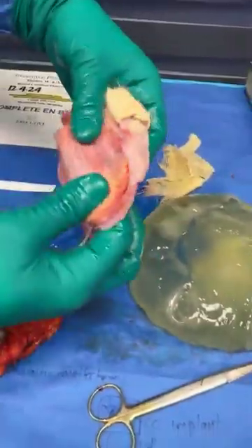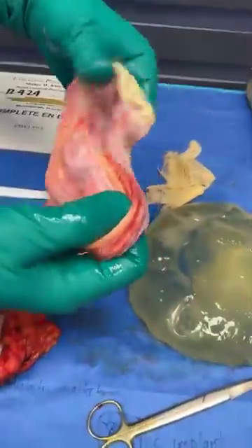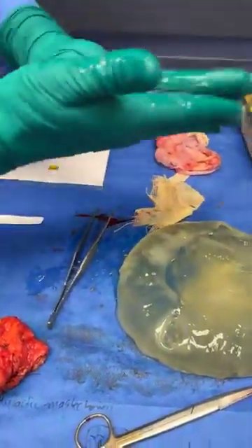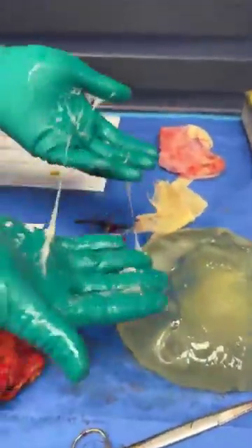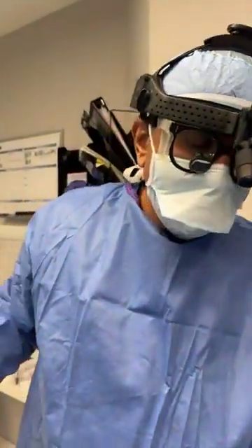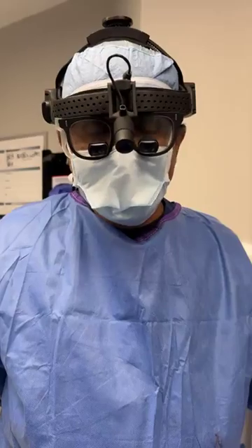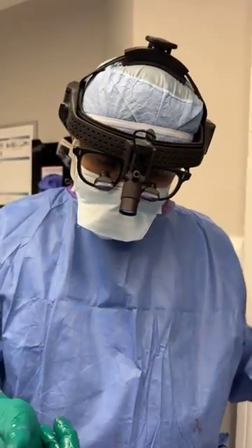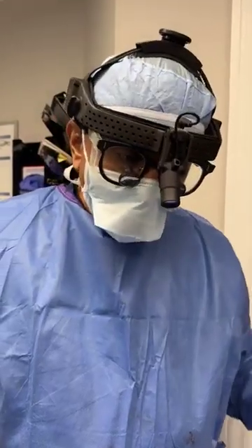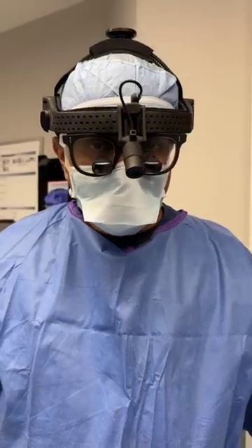The other thing I want to emphasize here is you can see some areas are so thin, as you saw earlier. So look at this. This is the nice, good, safe gummy bear implant? Absolutely not. They disintegrate just like the older ones. And the sad thing is this implant is just 10 years old. And you can imagine this didn't rupture yesterday. I do not know how long it has been ruptured.